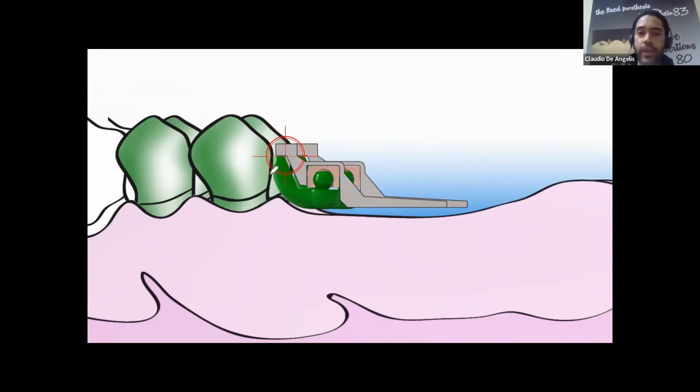So I reverse the lever, and in this case, it will become a kind of hook that will extract my crown and consequently the roots, the teeth on which my fixed part of the denture is located. Okay, it's just a geometrical matter.